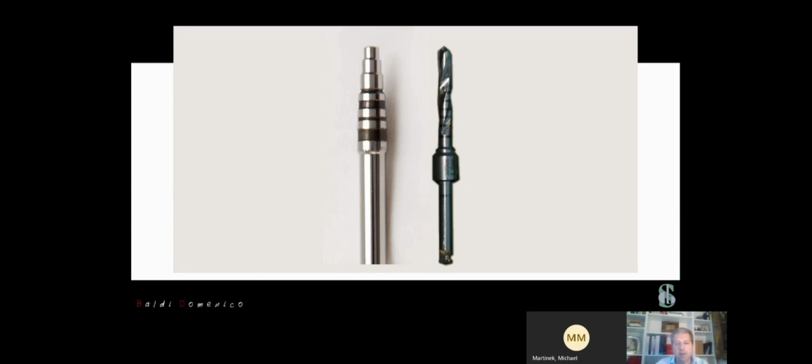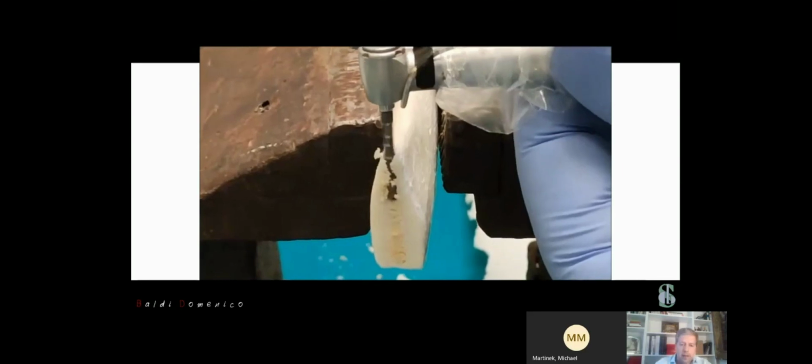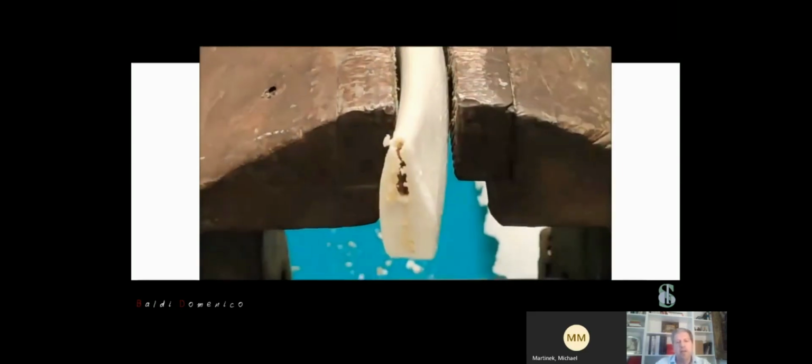Again, if we make a comparison between these 2 instruments, the burr and the magnetodynamic instrument, we can see the difference. Look here. In this video, you can see how we work on the bone with the burr. Look how traumatic it is, but it's normal because we have a macro movement of our instrument. So we can perforate the bone, but at the same time, we unfortunately destroy the trabeculae of the bone. And this is the final work.